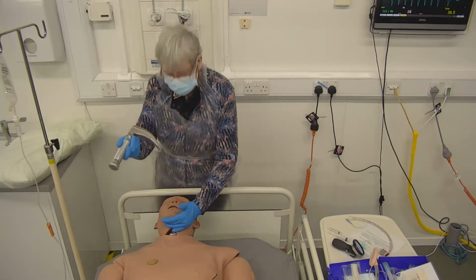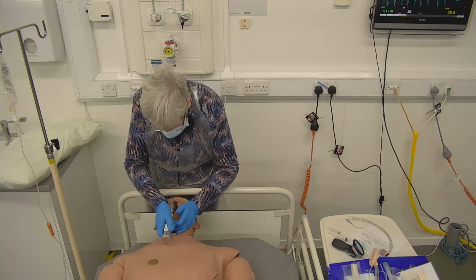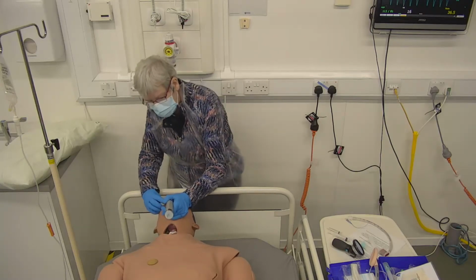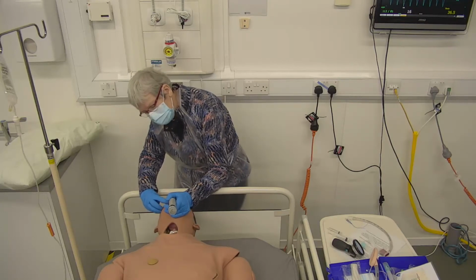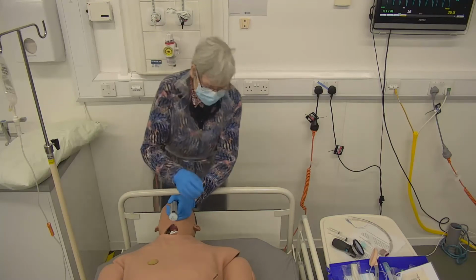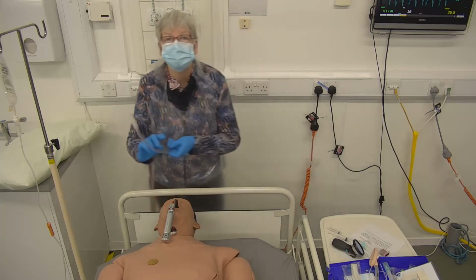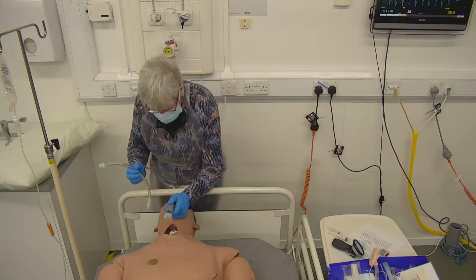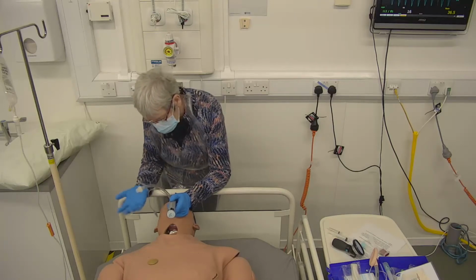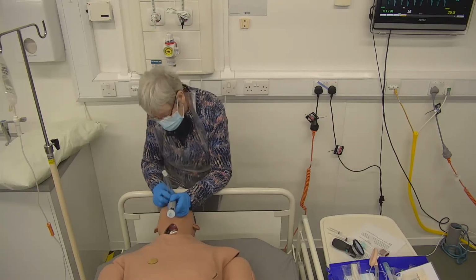So this goes into the mouth and depresses the tongue. It goes right back, with the head right back, and as I lift like that, I can actually see Mettiman's larynx. So the anaesthetist, this is not something that physiotherapists would do, I'm just showing you what the anaesthetists would do. So they would flatten the tongue and open up the larynx, and this person would not be awake right now. They would be anaesthetised and unaware of what was happening.